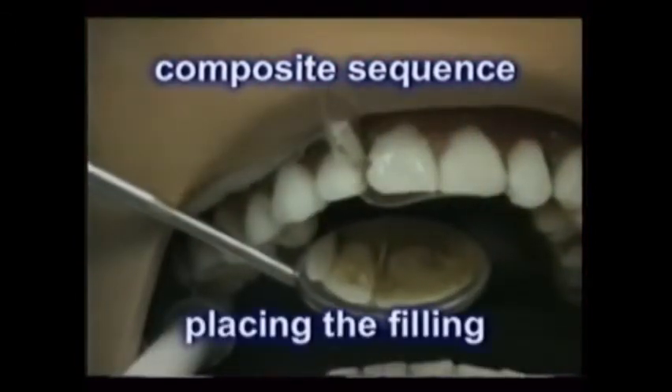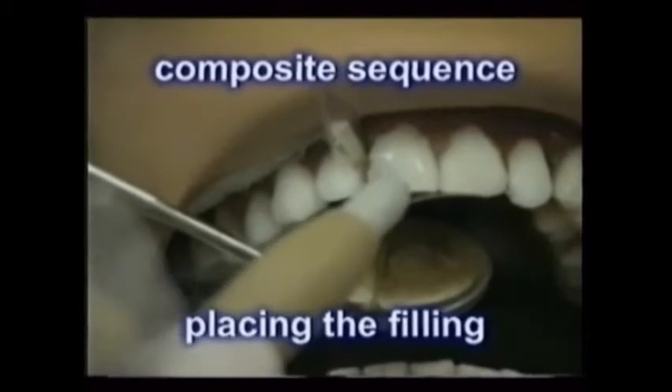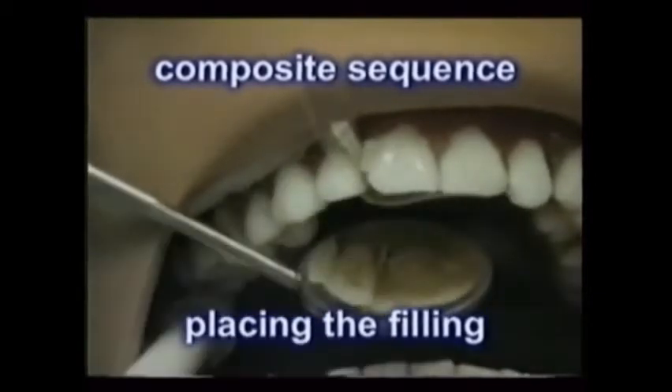This is followed by the placement of layers of the filling material, using either a syringe, a plastic placing instrument, or both.